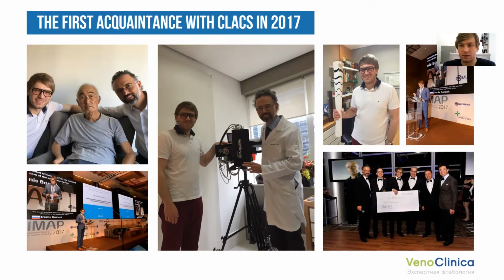That was when we first met Kazuo Miyake, his clinic, and his meeting, IMAP, the International Meeting of Aesthetic Phlebology. We were really interested in this method at that time. Then after 3 years of visiting his clinic and his conference, we believed in this method, bought the equipment for it, started to do CLaCS, and are really satisfied with this method.